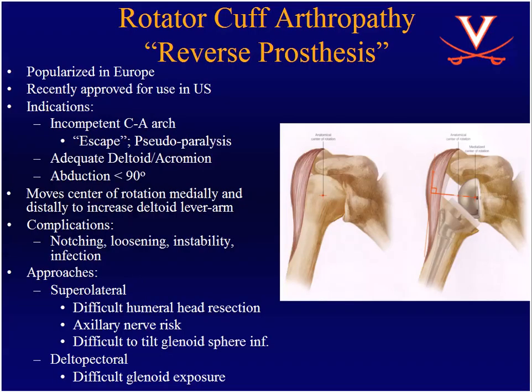And then along came the reverse prosthesis. Again, not testable, just for your information. This is coming along and can hopefully be a salvage for these patients with escape and requires an intact deltoid. We'll see how this works in the long term, but expect complications in the short term. So that's all we need to cover for that.